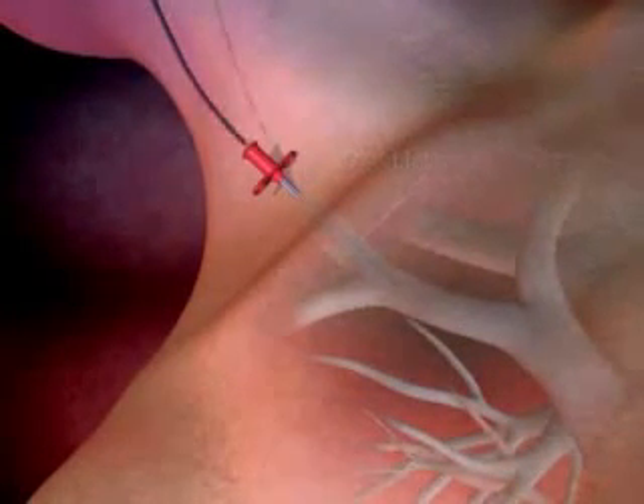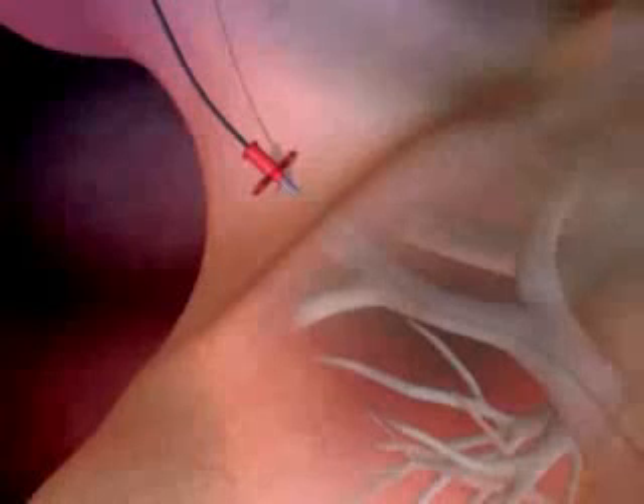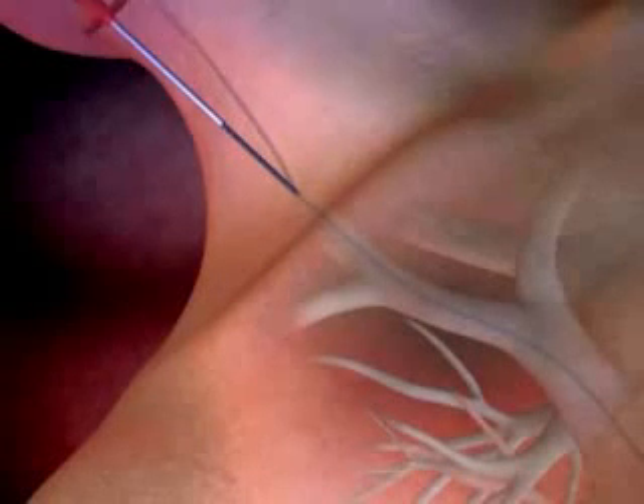Advance the guide wire until the tip resides in the inferior vena cava, or as far as is appropriate. Remove the needle, leaving the guide wire in place.